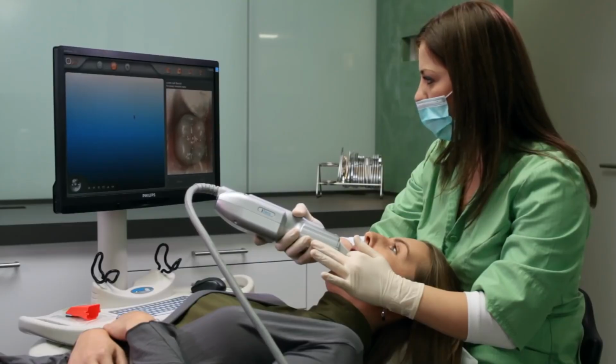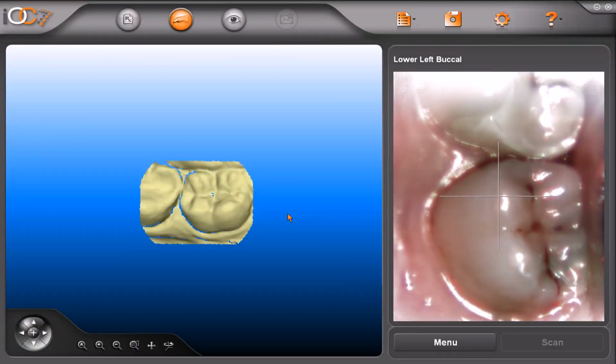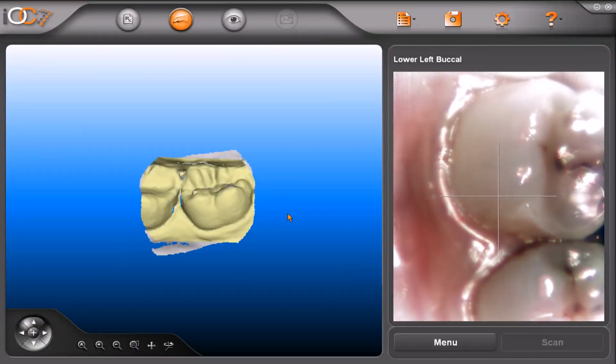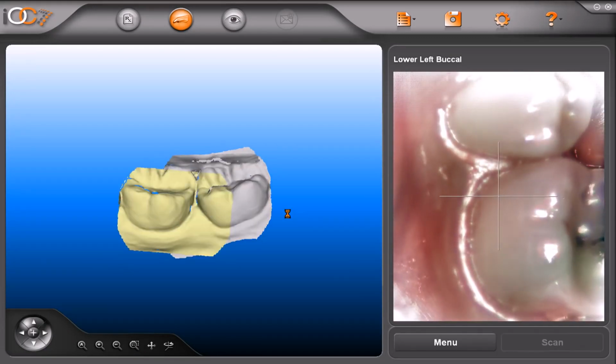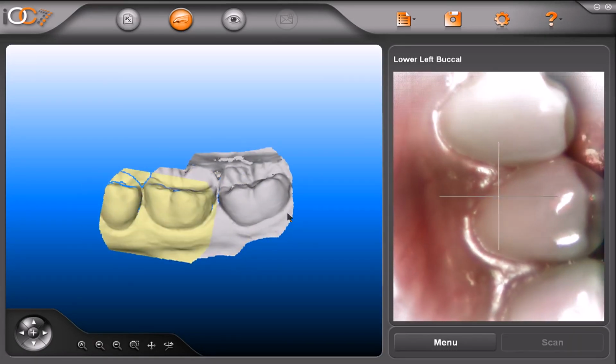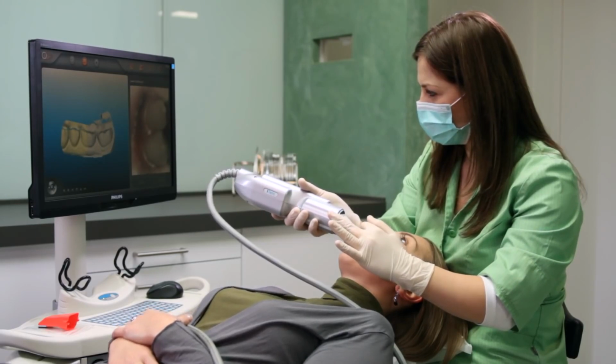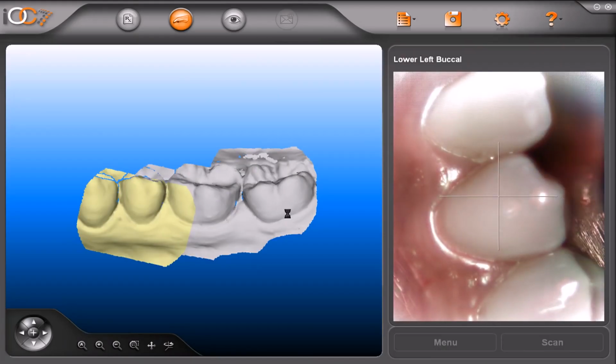To ensure registration, go to the most distal molar and capture the occlusal view. Now roll a little bit towards the buccal and move one tooth mesial each time while pressing the green foot pedal to scan. During the scanning process, pay special attention to the interproximal areas, making sure that these areas are also captured.